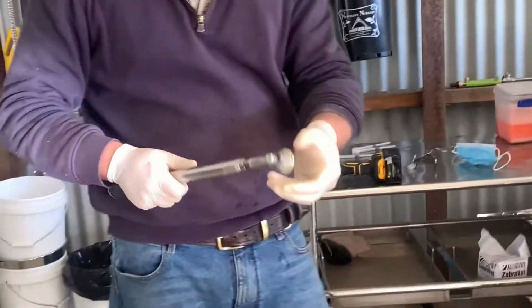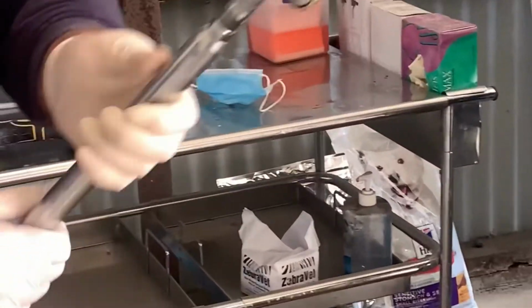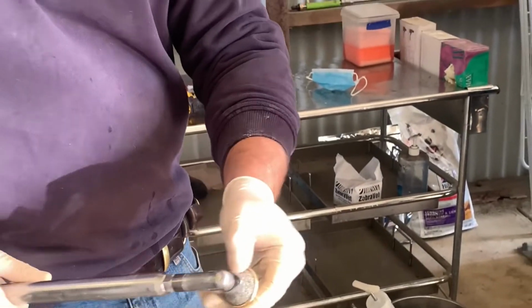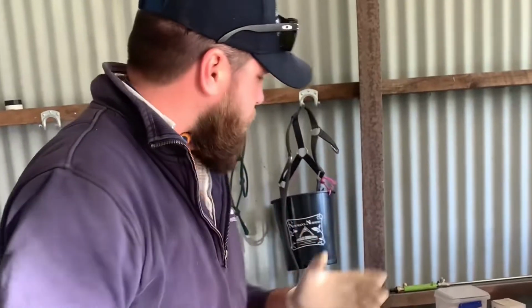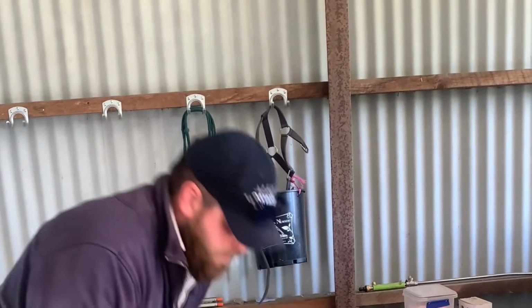You'll also notice that when we're using these tools, we're regularly putting them in the water and cleaning them up. That also acts as two functions. It keeps the enamel out of our tool as it starts to wear on it, but it also helps keep the tool cool. A lot of people say you can't do good dentistry with a power float because you kill the tooth and all this. That's all just rubbish, because what it gives us the ability to do is do a horse like that in that amount of time.